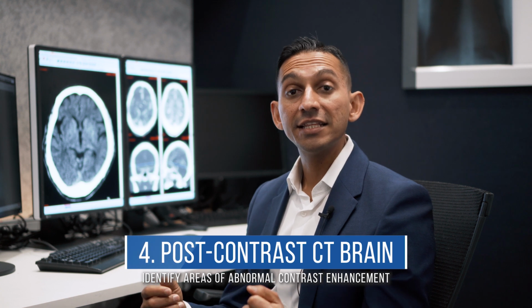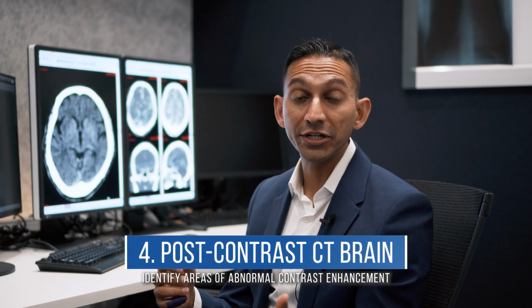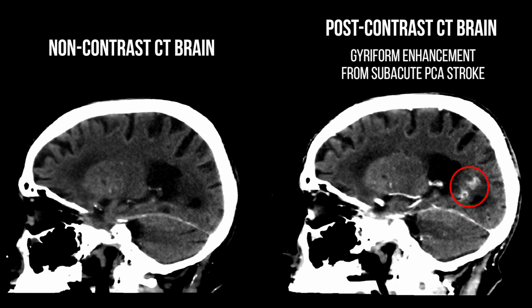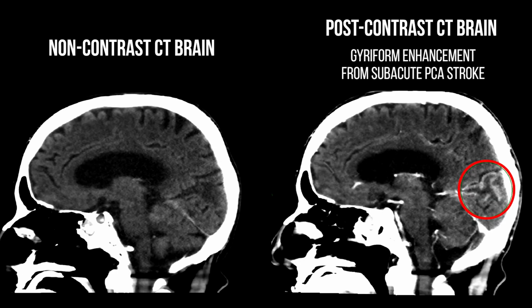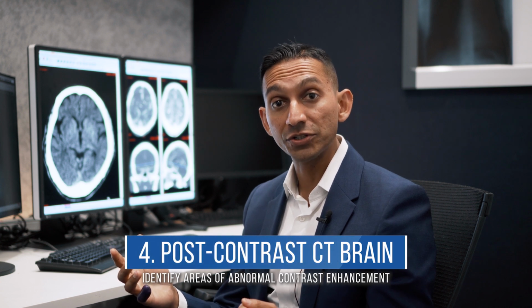Our final scan is a post-contrast CT. This is helpful in identifying areas of abnormal contrast enhancement that may occur in subacute stroke or stroke mimics such as brain tumors.